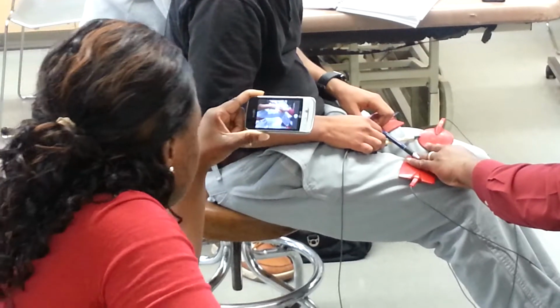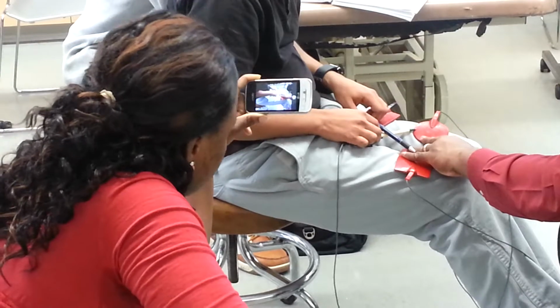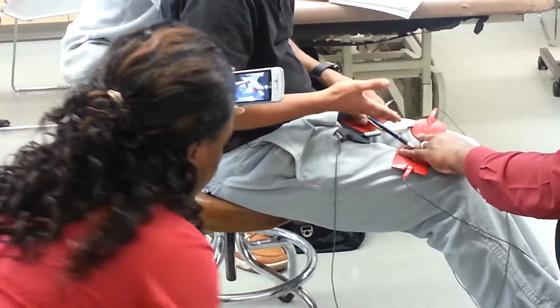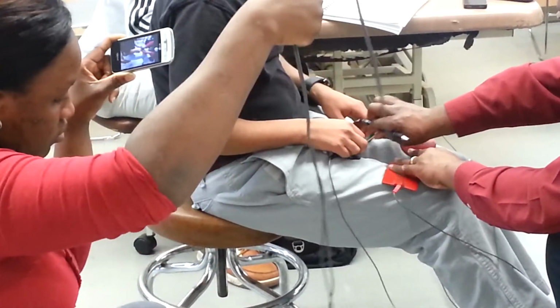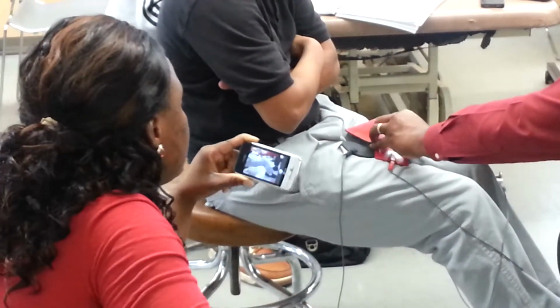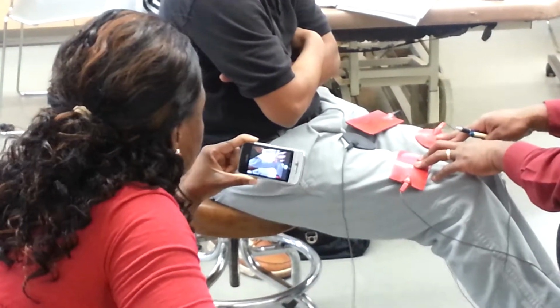There's the energy flow right there. Y'all see it? Yeah, because they're on the same channel. And sometimes we'll treat right there in the middle. So if a person has pain in the middle of the low back, we can't put it directly over top of the spine, but we can get it to go through the spine.